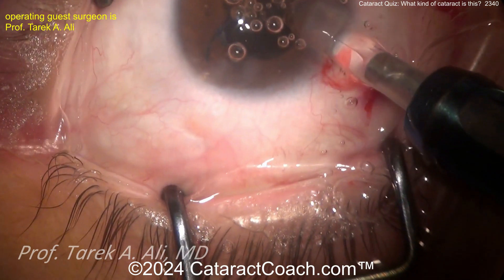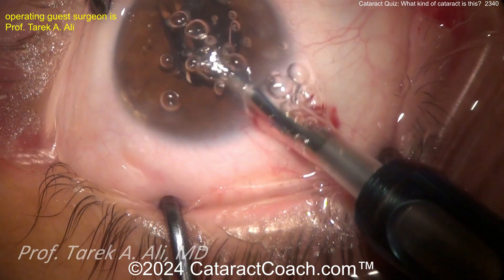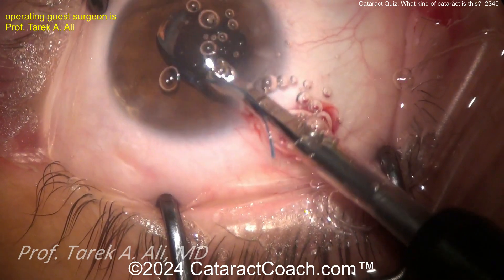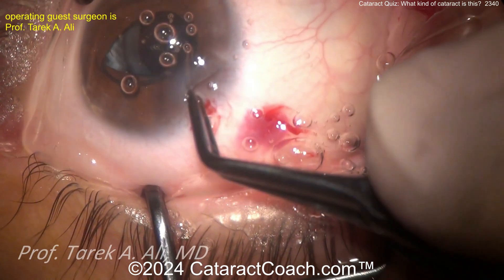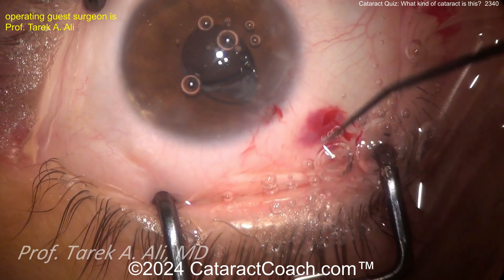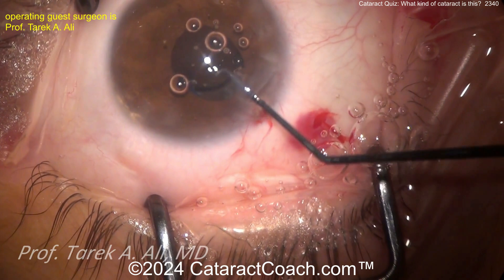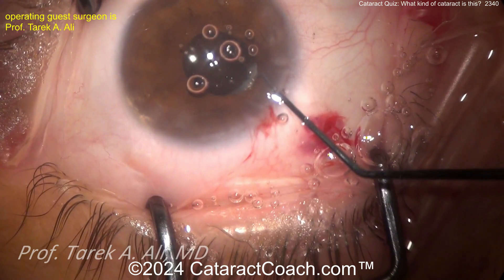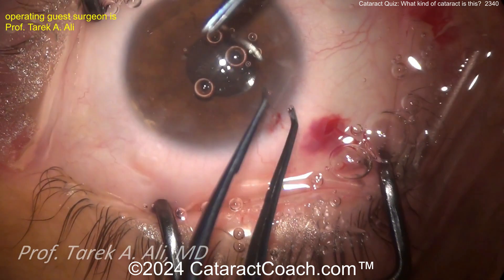Here comes the lens. You can put the lens on top of the iris and then slowly dial it in — that's an easy way of getting it in the eye first, and then you can figure out the positioning later. That's a reasonable technique. Now getting it in — looks like one haptic is already in the sulcus, here's the other one. Get that carefully rotated — there we go, that looks pretty good. Sulcus lens — a good option.